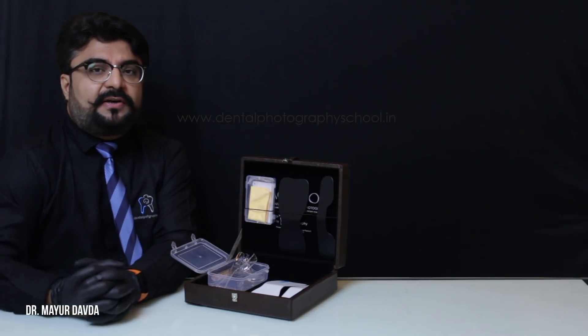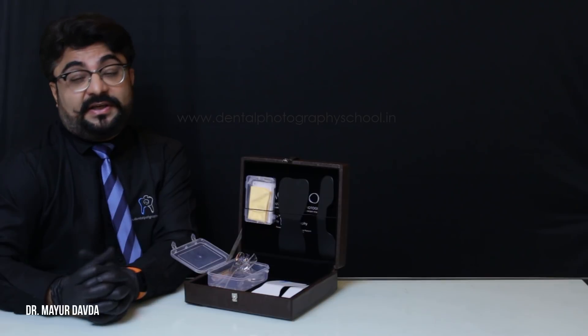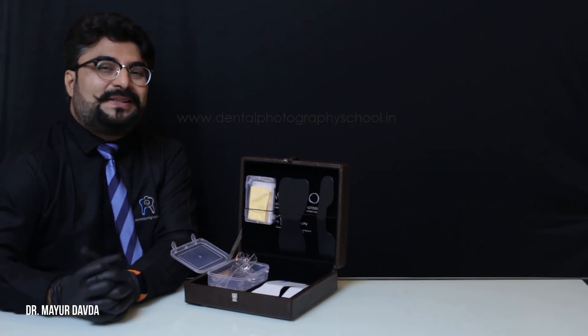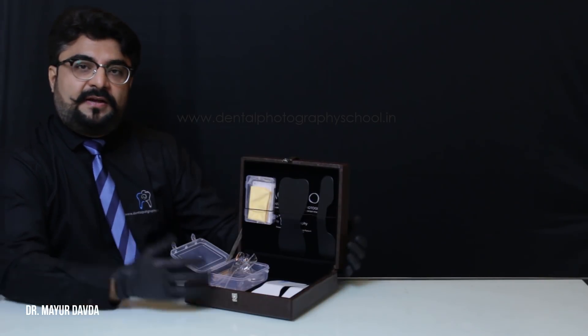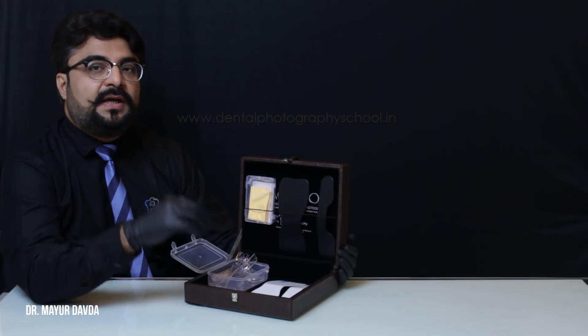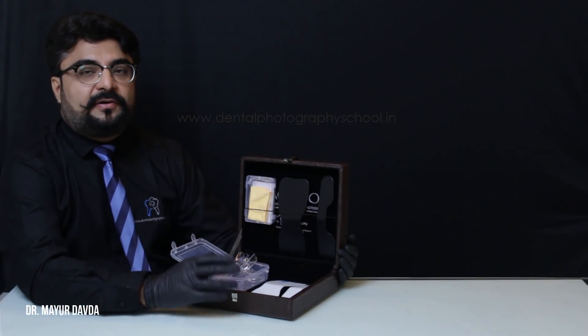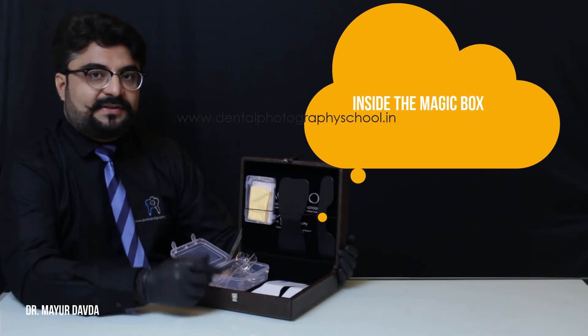We noticed that all the dentists had to hunt for all these accessories individually. That's why at Dental Photography School, we thought we should come up with a complete set of intraoral accessories — that prompted us to come up with something called the magic box, which has all the intraoral accessories required by any dentist for any kind of documentation purposes.